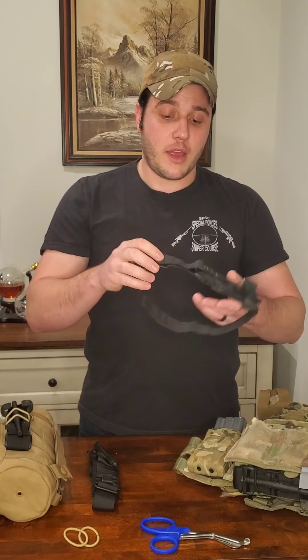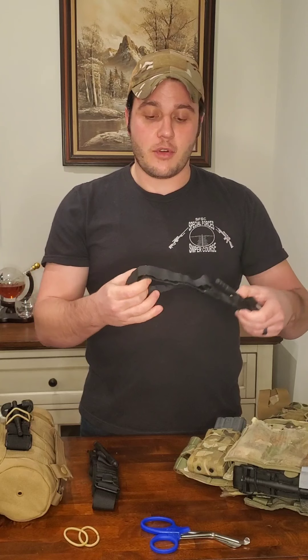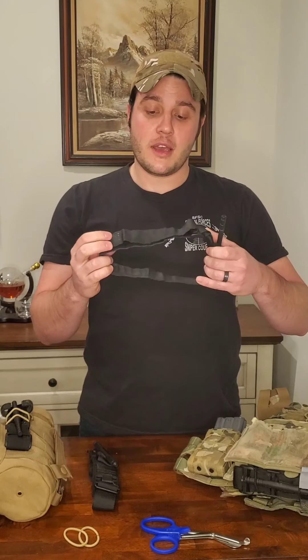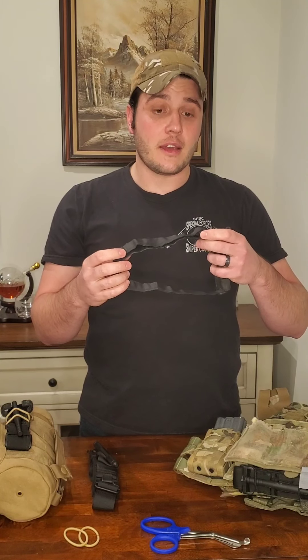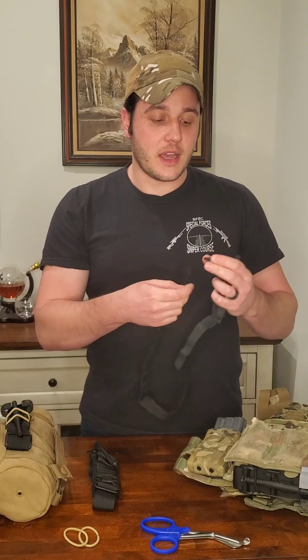That's application of your tourniquet on something like an arm. My tourniquet here is prepped — it was folded up, and when folded out there's a running tail end, about a six-inch piece ready to go into a loop. The only difference to apply this to a leg: it may be difficult to slide it up and over, so you un-Velcro it, pull it out of the buckle, slide it around the leg, and then run it back through.